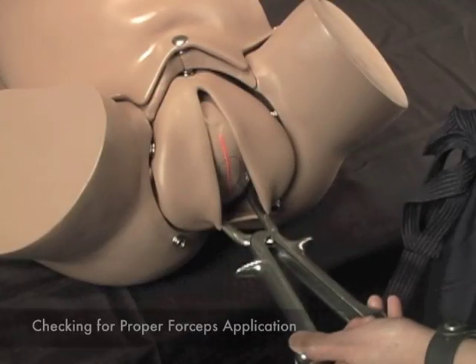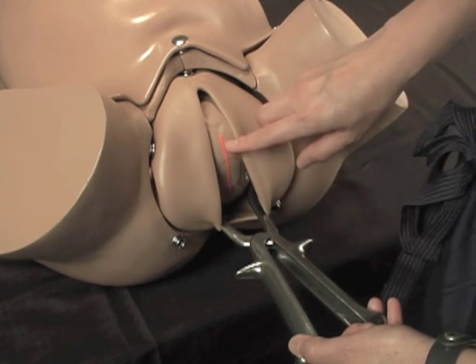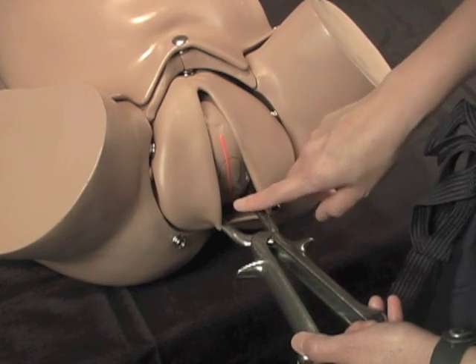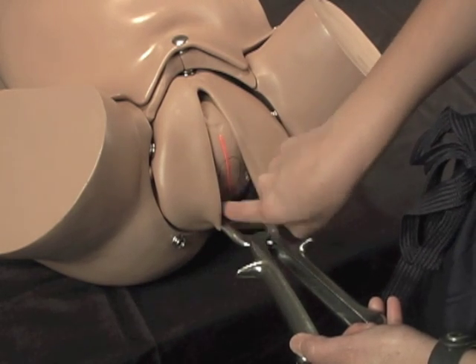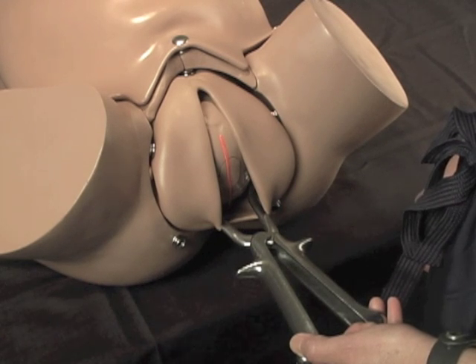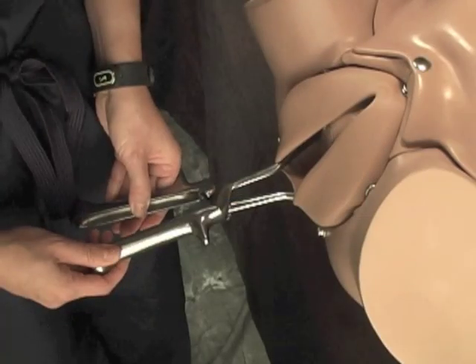Check for proper application prior to locking the handles. The sagittal suture must be perpendicular to the shanks. The posterior fontanelle should be midway between the shanks. The fenestrations of the blade should be equal on both sides and barely felt. Check proper forceps application prior to applying traction, and check fetal head position. Then lock the handles.